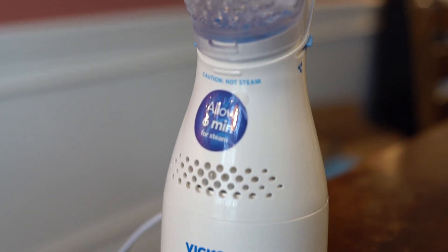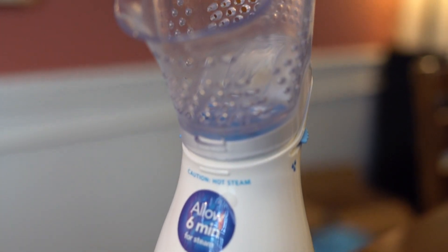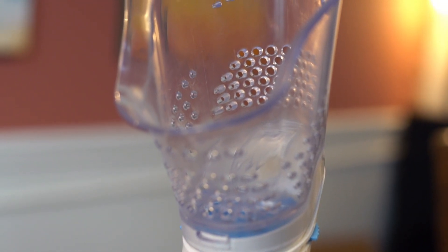Overall, this steam inhaler is nicely designed, easy to use and maintain, and this pack is highly recommended.